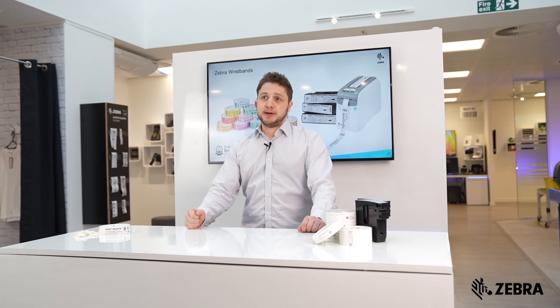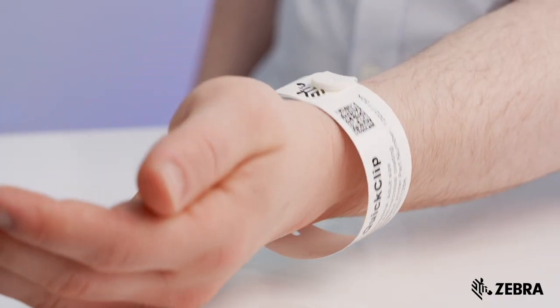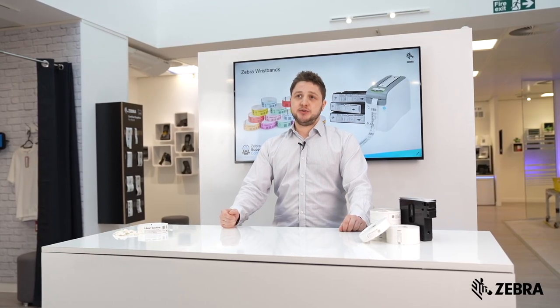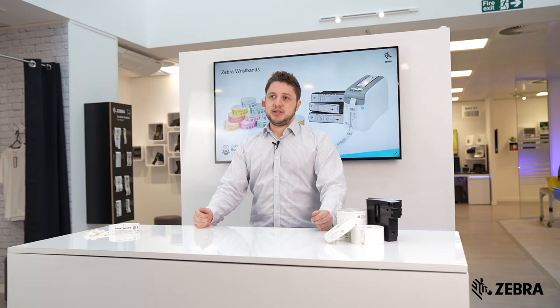Our QuickClip wristband is fastened by a clip which cannot be taken off without extreme difficulty. This ensures that the band will always stay attached to the patient's wrist before it's cut off. The clips come in a variety of different colours which can be used to identify a patient's needs — so for example, if a patient has an allergy, then a red clip can be used.